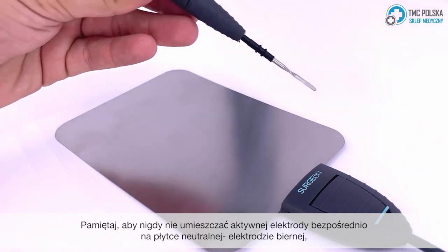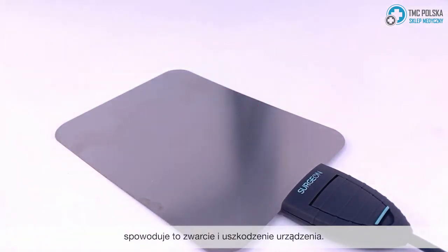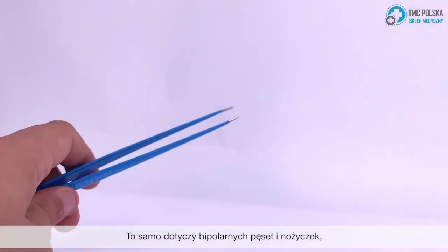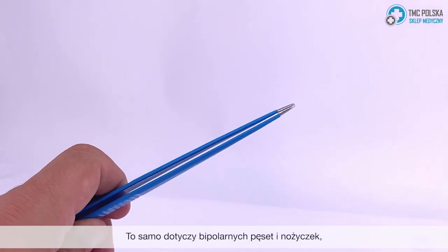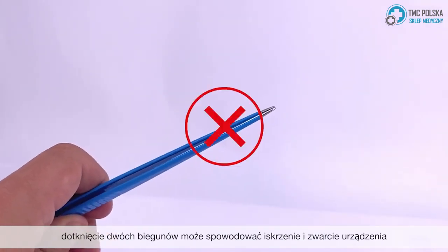Remember to never place the active handle directly onto the neutral plate. This will short circuit the device and cause internal damage. The same can be said with bipolar tweezers and scissors — touching the two poles can cause sparks and will short circuit the device.